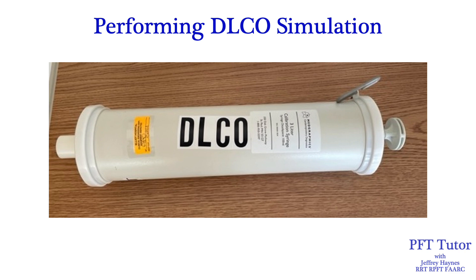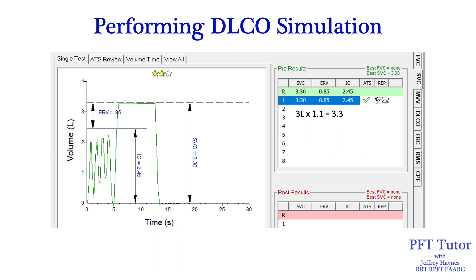Ideally, the syringe used for DLCO simulation will not have a hose or a filter attached, because that will add dead space and you'll need to account for that amount of dead space. Because you are performing DLCO simulation in patient testing mode, most software on the market is going to require you to perform a vital capacity first, so the acceptability of the inspired volume can be judged. During DLCO, patients should inhale at least 90% or greater of their largest vital capacity. You can do this as a forced vital capacity or a slow vital capacity.